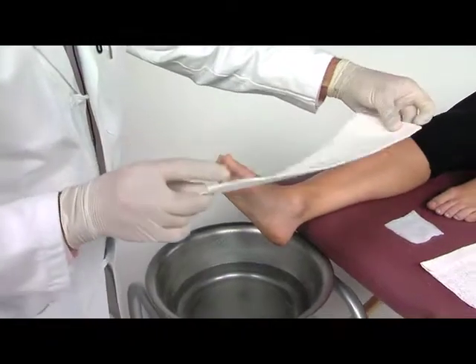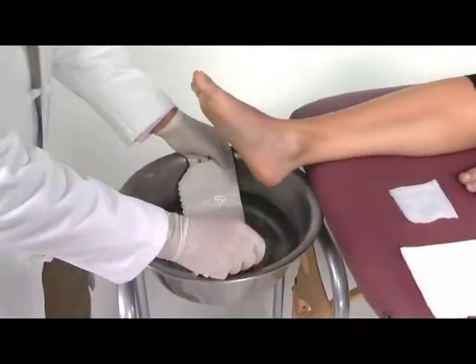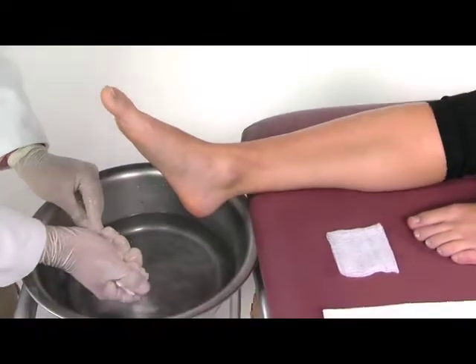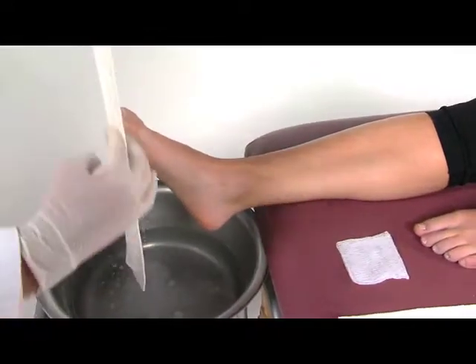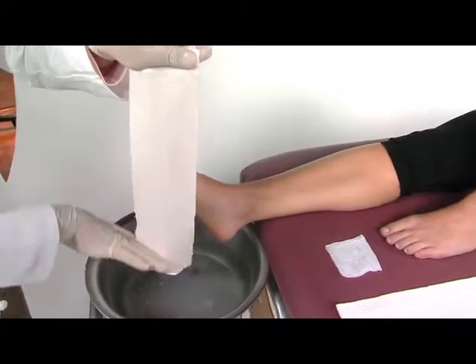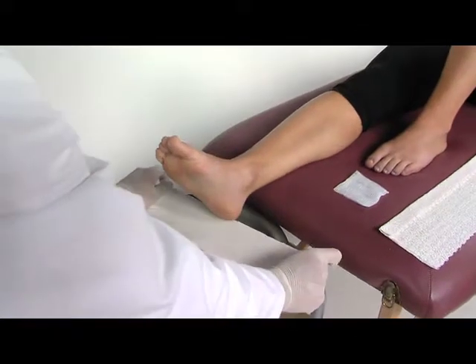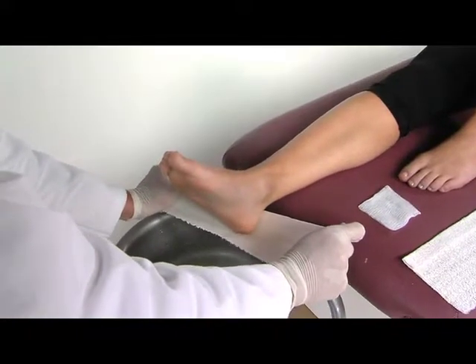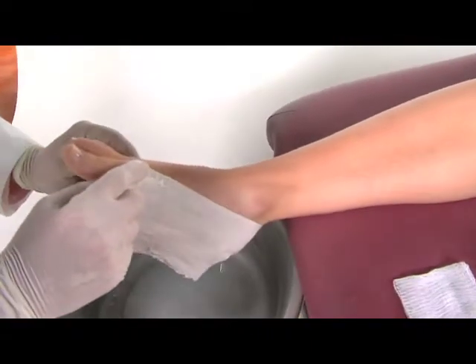So let's start by taking the plaster splints, which you've already folded over about three-quarters of an inch. Go ahead and dip it in the water like that. Gather it in your bottom hand and bring the water out like that. I like to take my fingers and smooth the plaster splint out just like that.